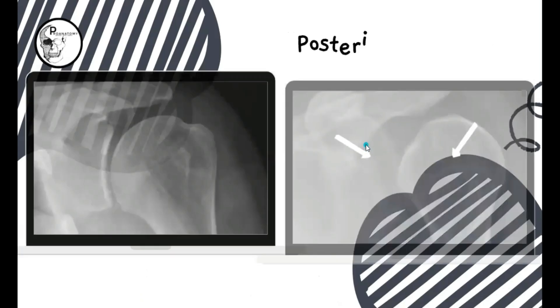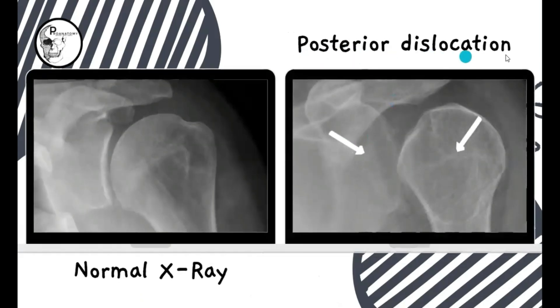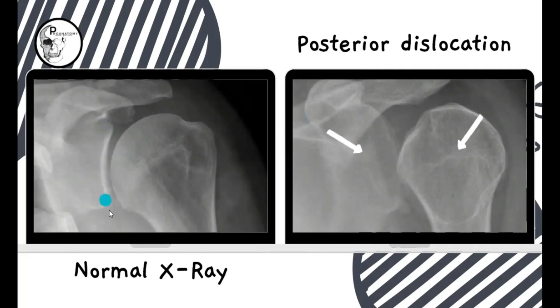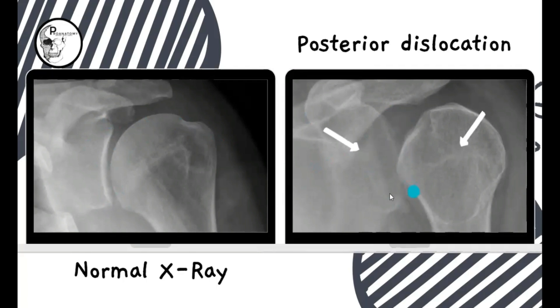The second type is posterior dislocation of the shoulder. There are some important facts to notice here. On the left side, the normal X-ray shows the glenoid cavity and head of the humerus clearly. On the other side, there is an increased joint space and you are not able to make out the margin of the head of the humerus because it is irregular.